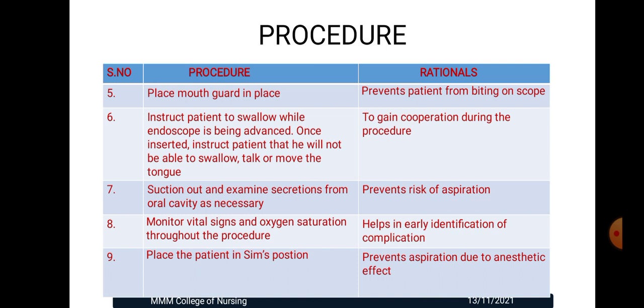Monitor vital signs and oxygen saturation throughout the procedure. It helps in early identification of complications. And place the patient in Sims position. It prevents aspiration due to anesthetic effect.